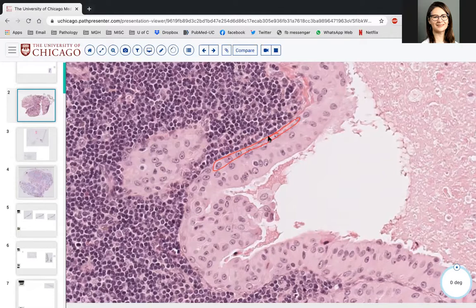And this is true for other oncocytic lesions of the salivary gland. So this P63, P40, I'm just going to write P40 here, is present in Warthin tumor, in oncocytoma, and so that can also be sometimes helpful in distinguishing some of these lesions from others. So, okay, questions on Warthin?